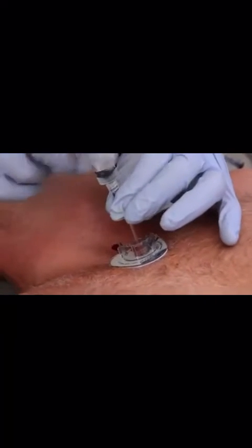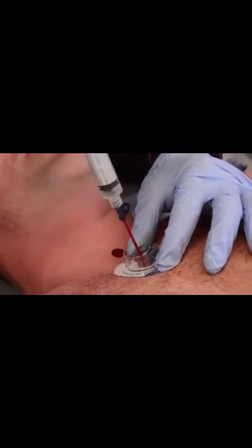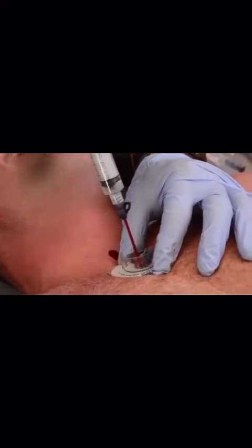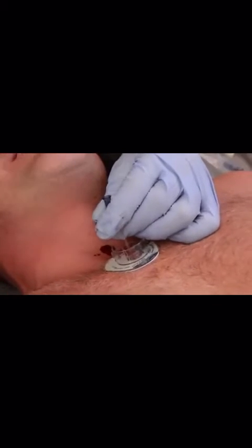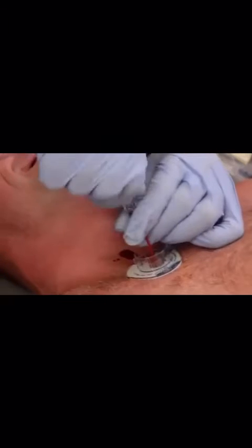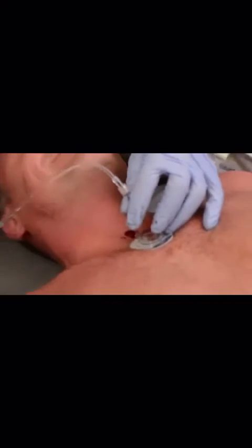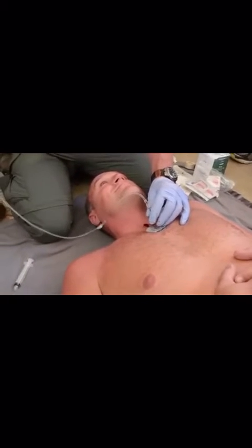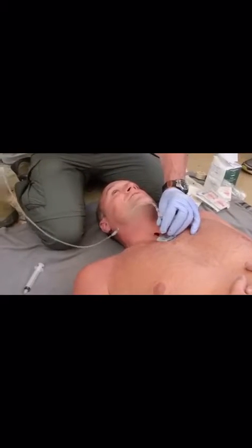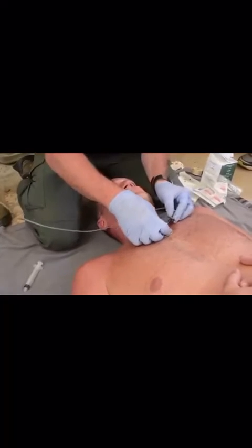Follow your medical direction and control for this next step. Before hooking up the IV line, it is recommended that you aspirate marrow and flush to clear the tip of the infusion tube. During aspiration and flush, patients sometimes remark of a low level of discomfort in the form of a quick visceral pinch. Once aspirated, the IV tubing and bag are connected to the infusion tube and the flow begins immediately. On a pain scale from 1 to 10, the patient claimed he felt only minor discomfort on a level of 3 or 4 for a second or two.